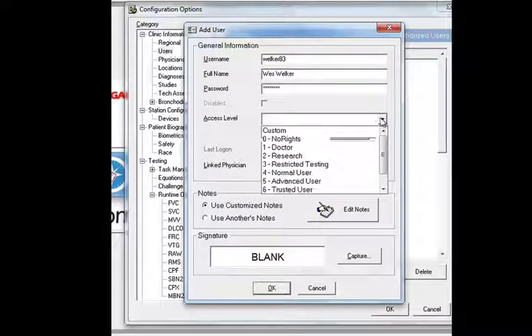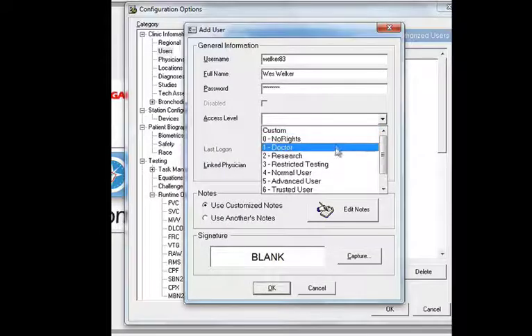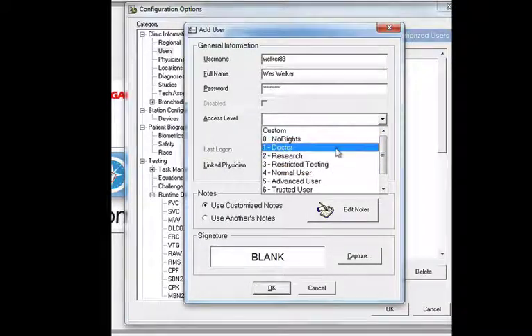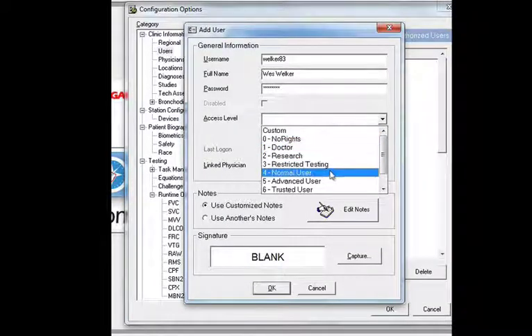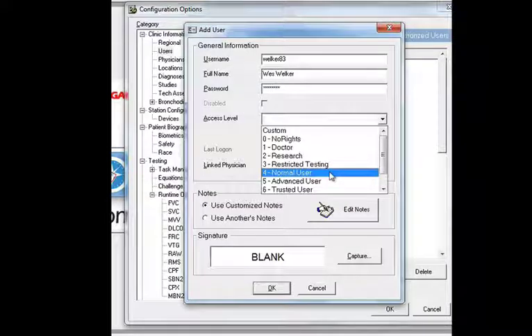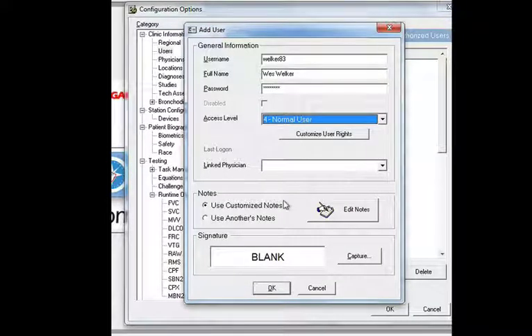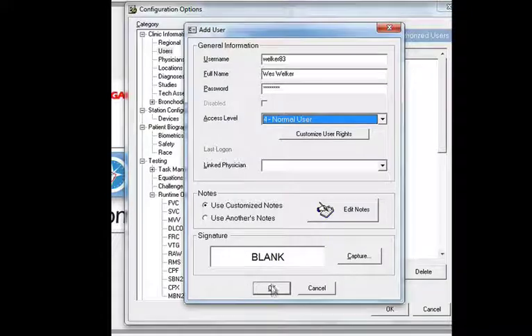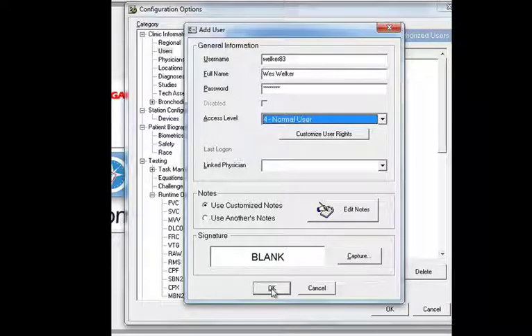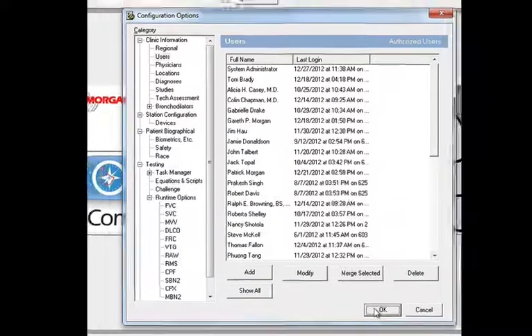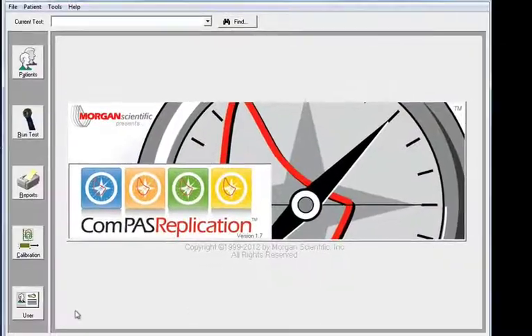Now you can choose the account level. Depending upon the type of user, you want to give them different rights. But for a technician, you typically choose Normal User. Select OK and exit out of Configuration Options.